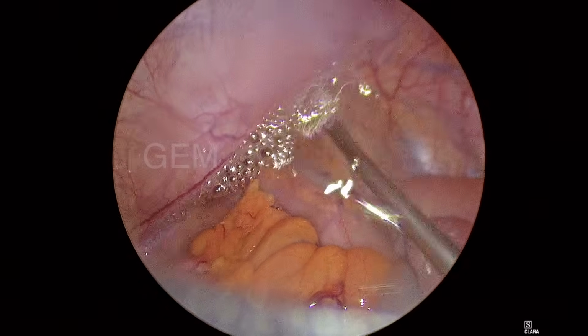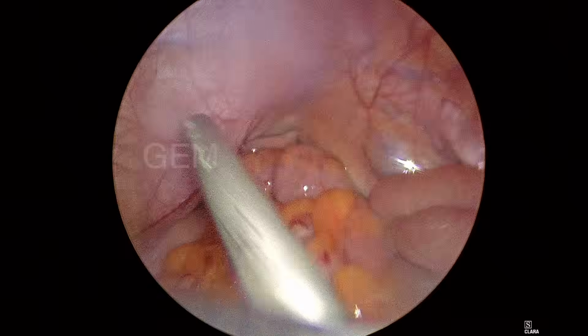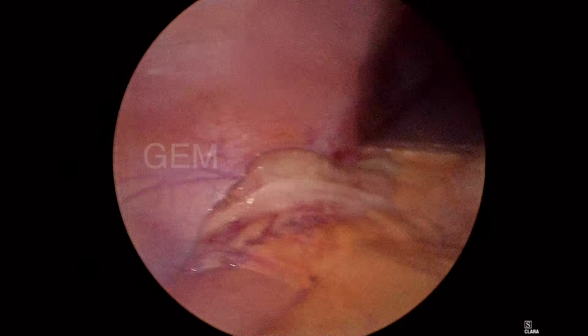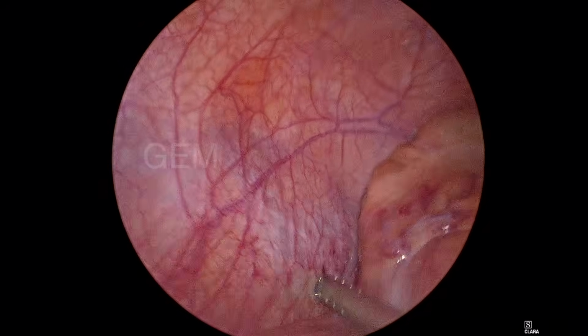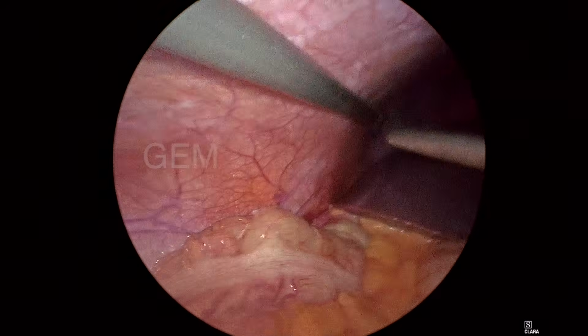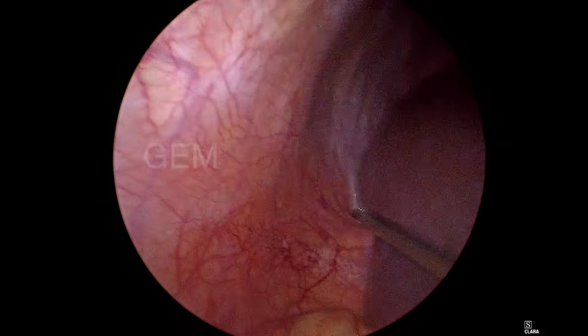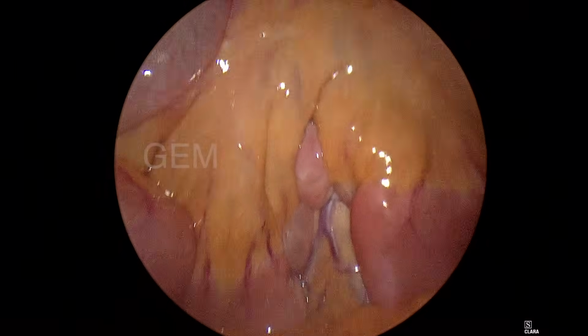One surgeon asked in a comment about a good view, so definitely you will get a very good view with the suprapubic port. You are able to see all quadrants by keeping the camera in the suprapubic port. So this is the end of the surgery.